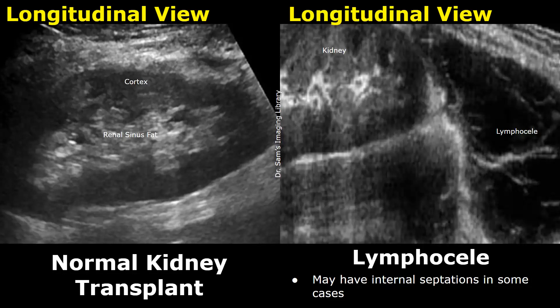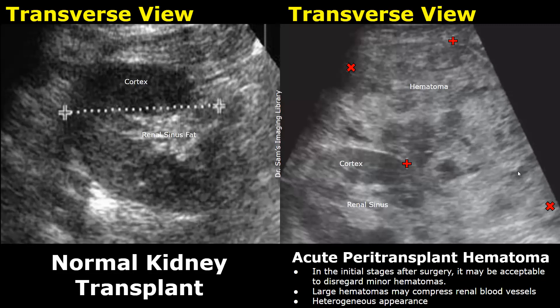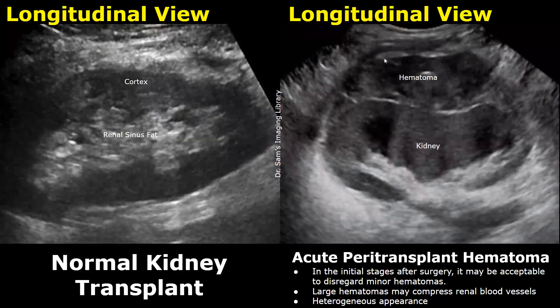Peritransplant hematoma is common in the early postoperative period. Small hematomas can be ignored, but large hematomas are concerning as they may compress renal blood vessels and other renal structures. This is an acute peritransplant hematoma — it usually appears heterogeneous, and the appearance depends on its age. Here is another image of acute peritransplant hematoma; we can see a heterogeneous mass adjacent to the transplant.